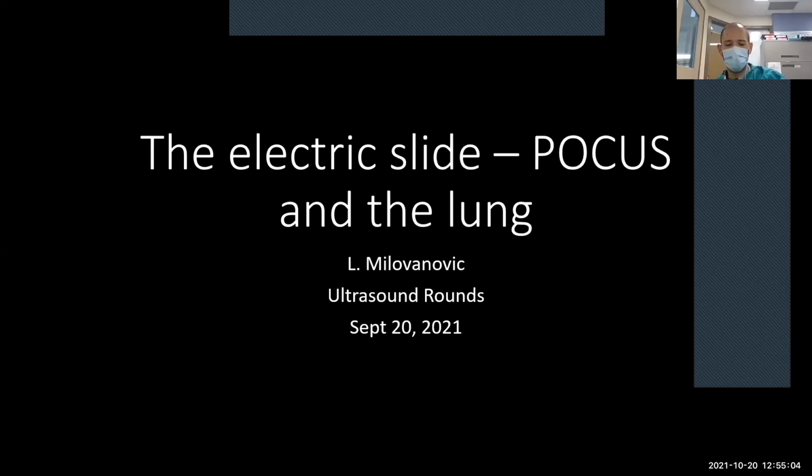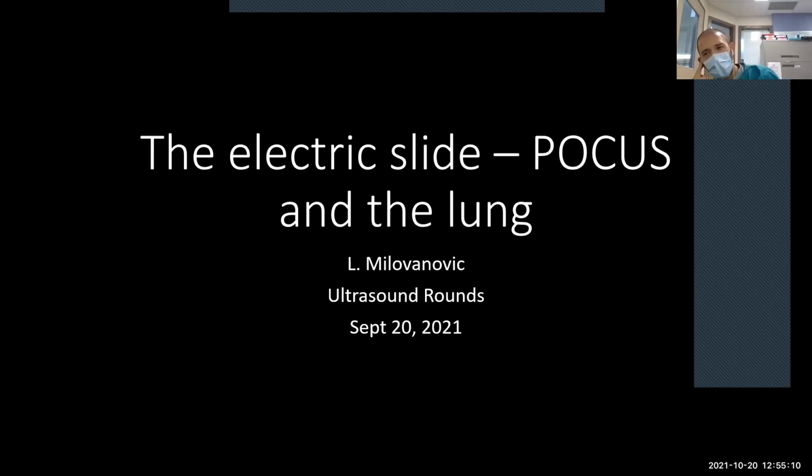We'll do this quickly, guys. So this is meant to be interactive. This is meant to be essentially an assessment of how we can acutely use point of care ultrasound in the lung to help diagnose what is a medical emergency.